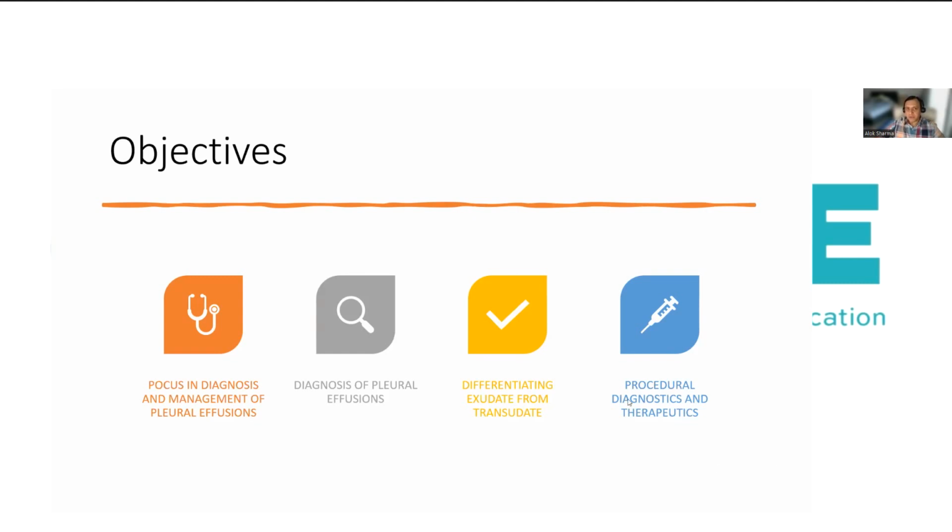However, one of the most important aspects of my discussion today will focus around how you use lung ultrasound to help with therapeutic thoracentesis. And I think for me, that is something that I feel at this particular point should be mandatory when you're trying to manage a pleural effusion, because it helps you in a large number of ways.